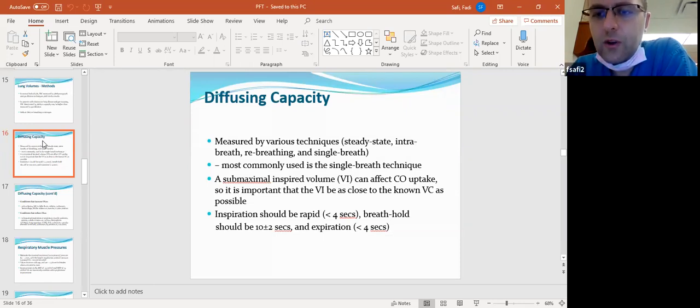So the amount of the gas that you exhale should be very small, negligible, right? Now, if somebody, like patients who have idiopathic pulmonary fibrosis, you give him the carbon monoxide, a certain amount, and then you ask him to hold his breath for 10 seconds. And then you measure the carbon monoxide that comes out of his mouth, and you find that it's big, then you know that the gas did not diffuse, right? So that is the way we measure the carbon monoxide.